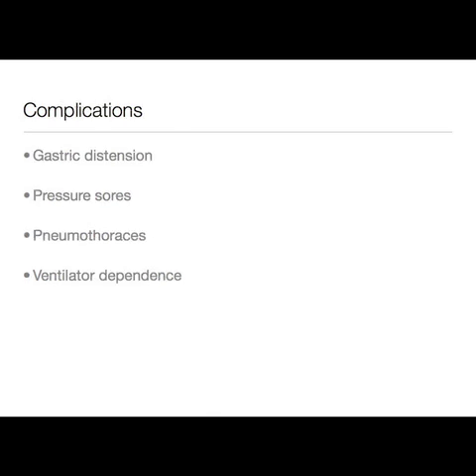So the complications of non-invasive ventilation include gastric distension, which is due to positive airway pressure pushing air into the stomach, pressure sores from ill-fitting masks, pneumothoraces, and ventilator dependence.